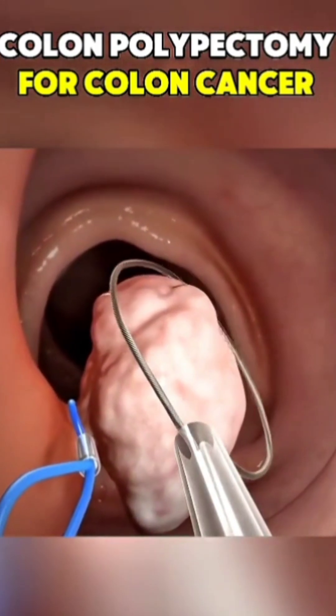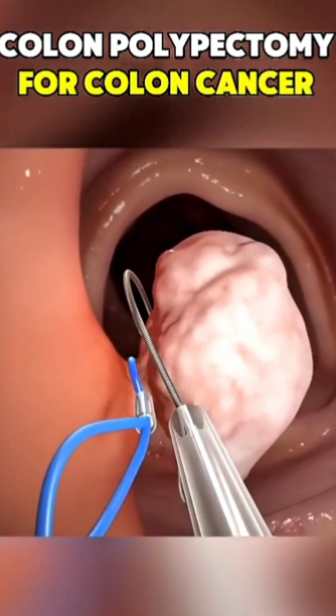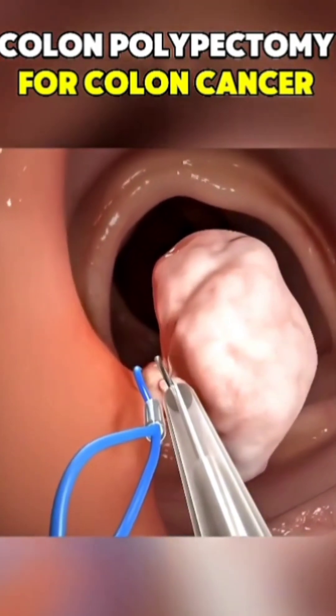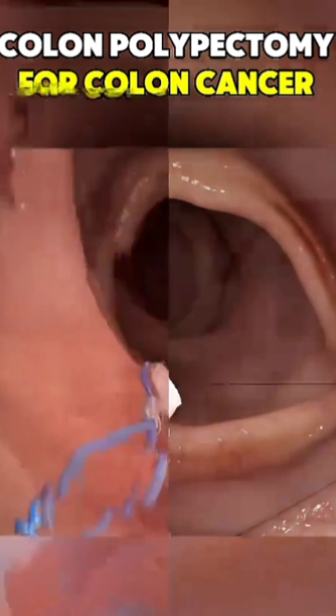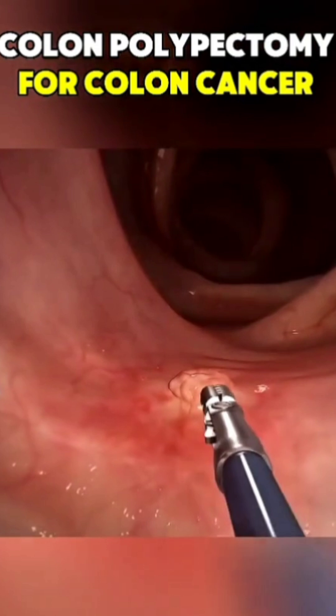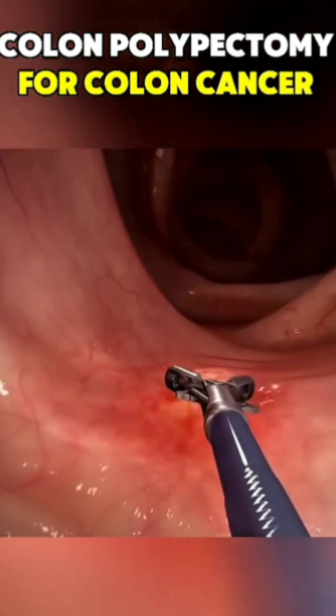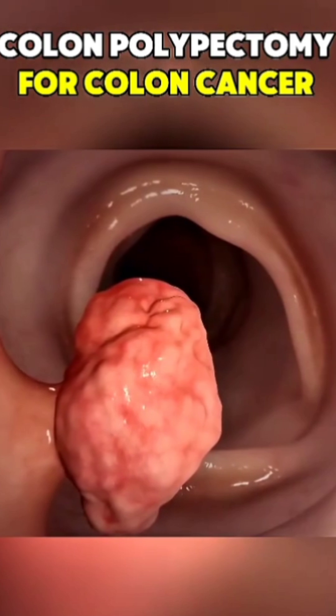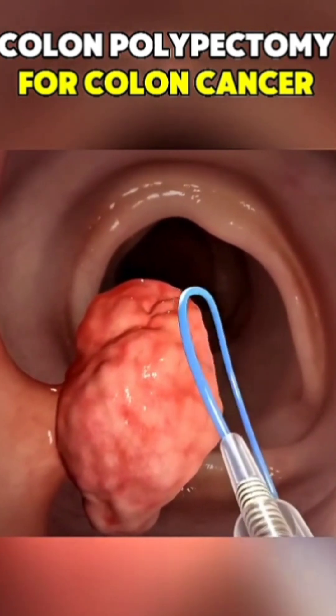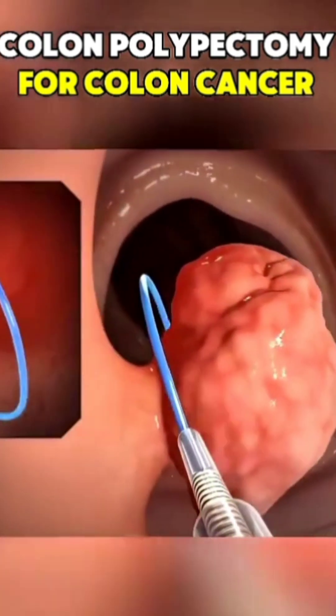Larger or flatter polyps? No problem. Special tools or injection techniques lift and remove them safely. You're usually awake and walking out the same day, with no incisions and minimal recovery. This simple procedure has saved thousands of lives by stopping cancer before it starts. So if your doctor recommends a colonoscopy, don't wait. It's not just screening — it could be life-saving.